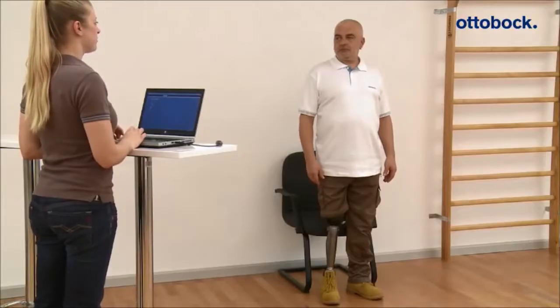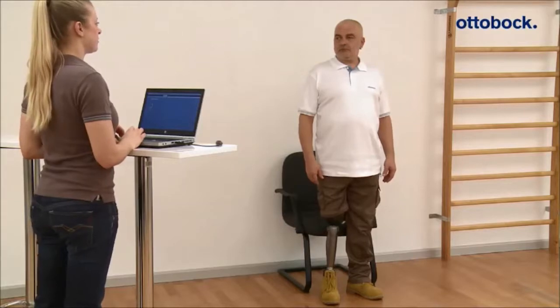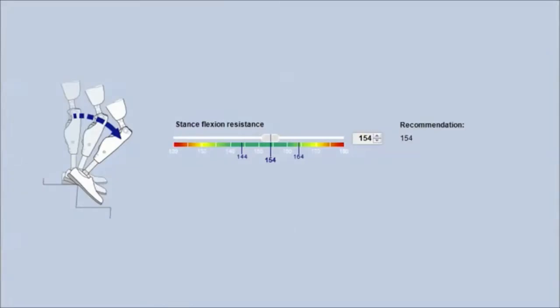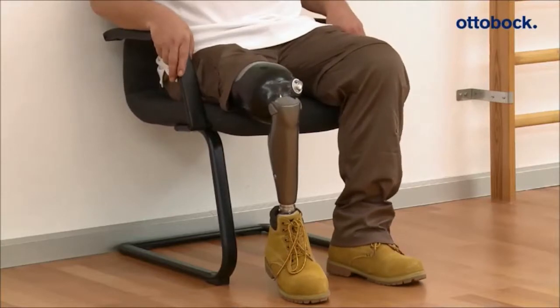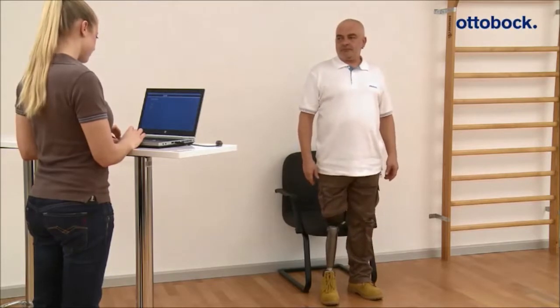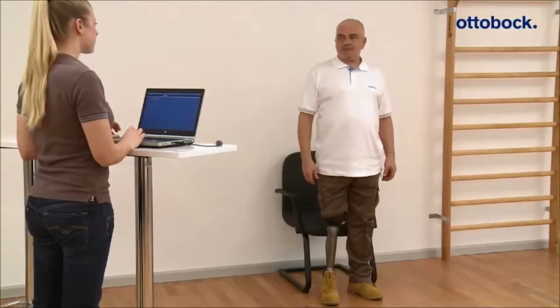The stance flexion resistance can be set up in the adjustment software for the patient individually. Based on body weight and lower leg length, a recommendation for the value is shown in the software in the field Recommendation. First, the adjustment stance flexion resistance is checked while performing a sitting down movement. The patient should be able to load the prosthesis while sitting down. The flexion velocity should meet the patient's need. The value can be adjusted via the adjustment software.